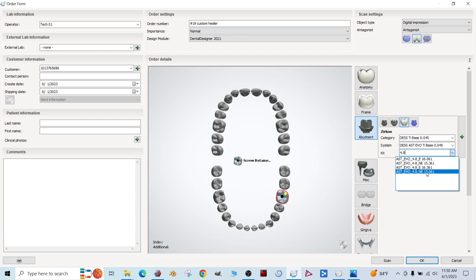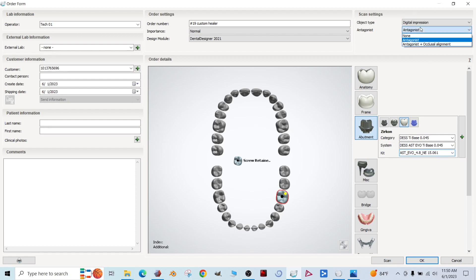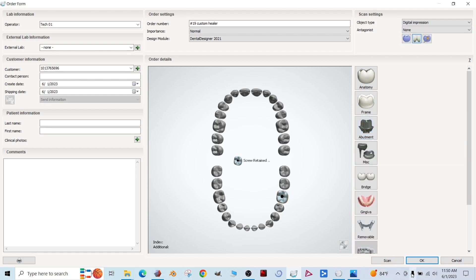And then we're going to use a 4.8 non-engaging tie base. There we go. 15.061. So that's the file we want to use. I see it flipped so that there's an antagonist. I'm going to switch that to none for this case. All right, let's click OK.